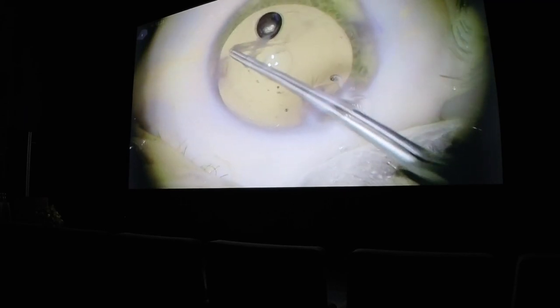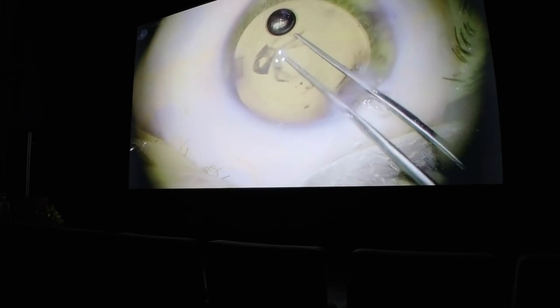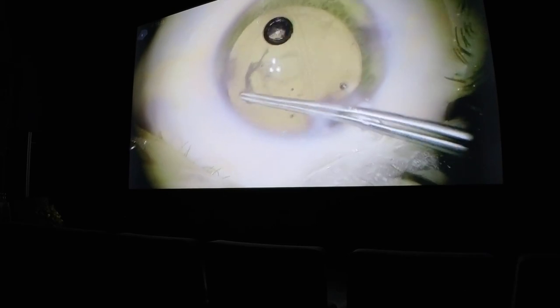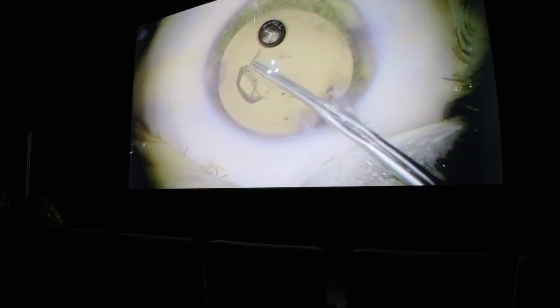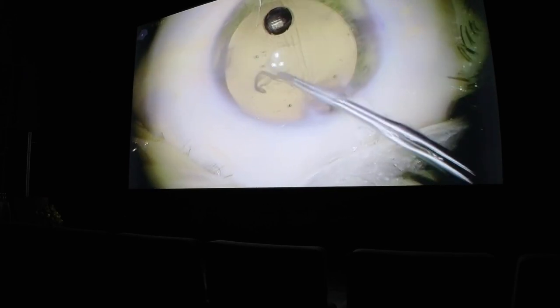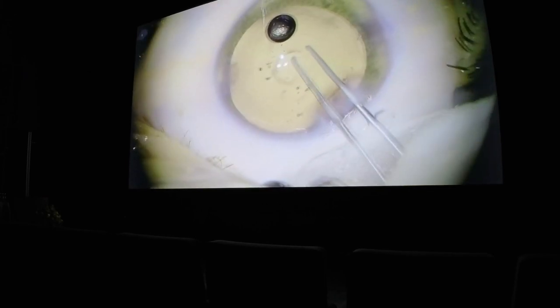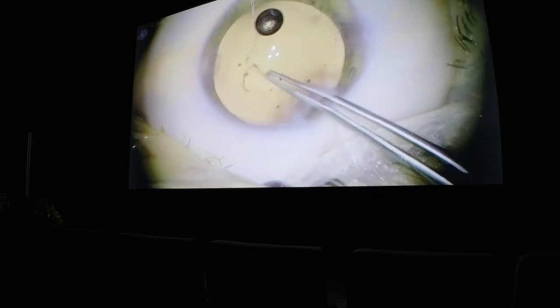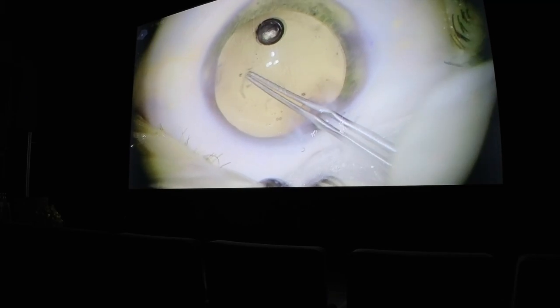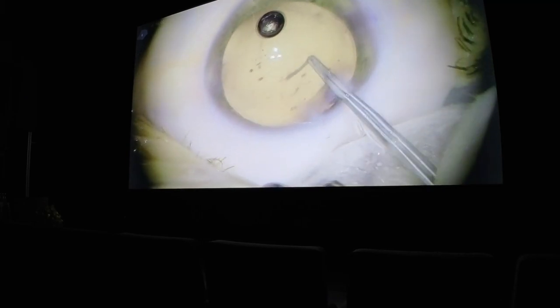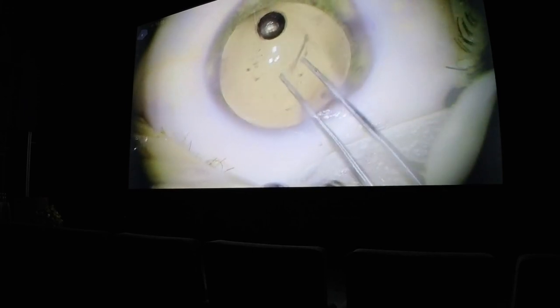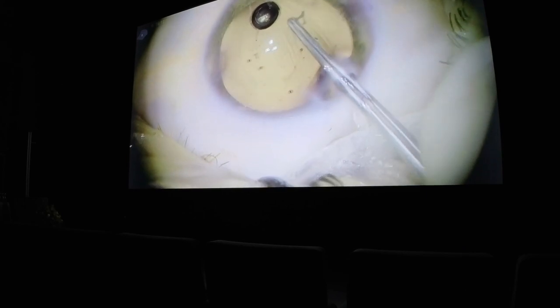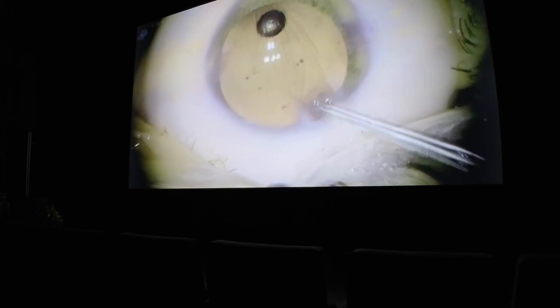Here is the posterior capsule, and then you see the anterior hyaloid — the smaller circle. You can imagine if you need to do this through the oculars, you will be leaning forward to the microscope. On top of the tension of performing posterior capsule rhexis, you will have the muscular tension of your back and neck also, dividing your attention to maintain your position and to do the rhexis. With heads-up, at least for me, it's easier.